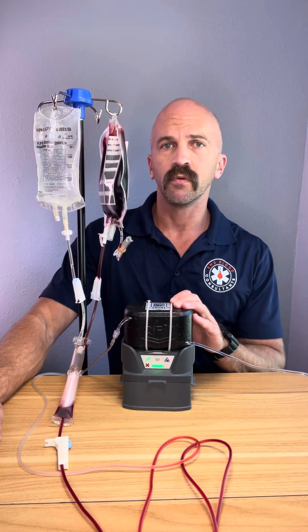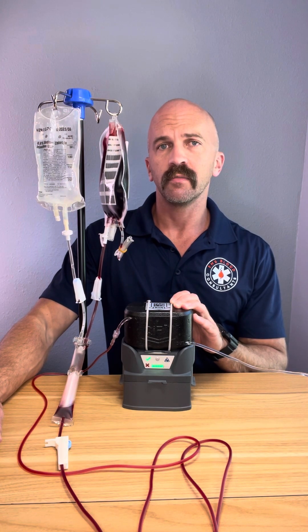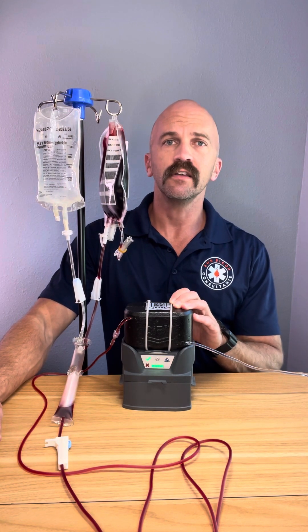Again, this is the Q&Flow Warrior Light. If you have any questions about starting a whole blood program at your EMS agency, give me a shout at EMSblood.com.